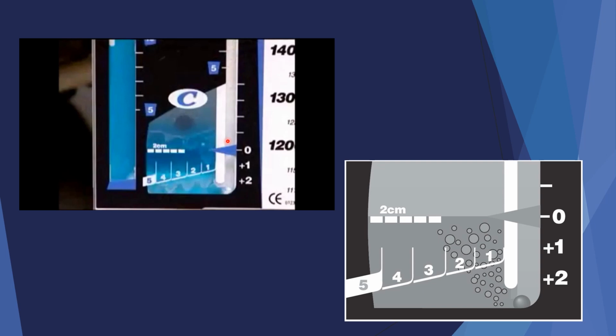If you're assessing your patient and in the morning when you looked at it there was no bubbling, and now you see bubbling, you need to investigate for an air leak. There's a possible air leak. What we need to do is start looking from the connection all the way down to the suction and try to troubleshoot it.